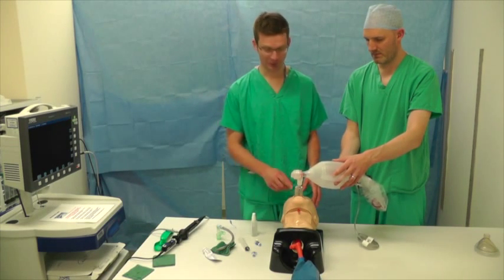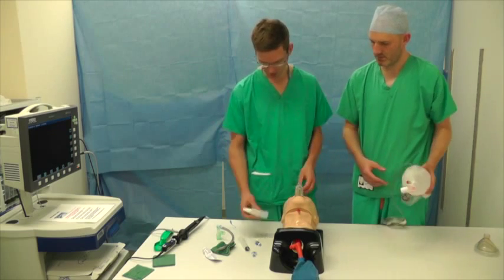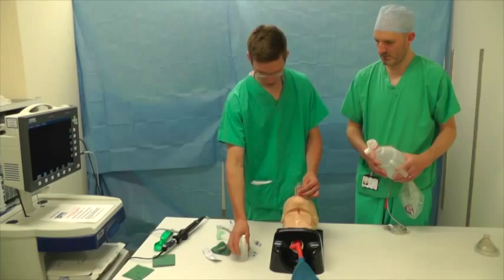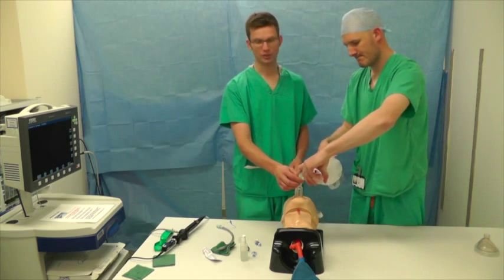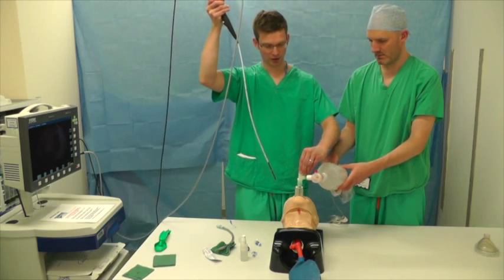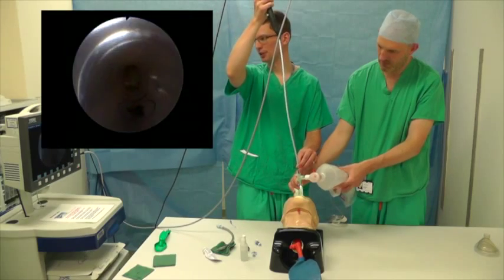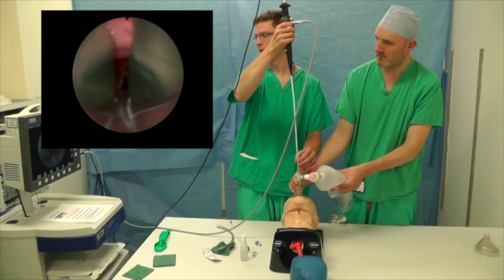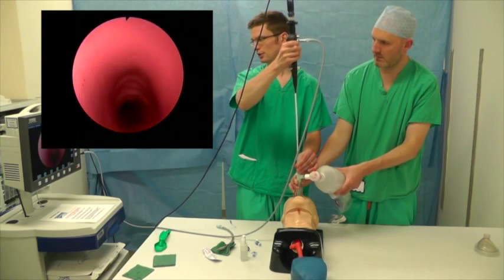Once you're happy you can ventilate, you need to lubricate the inside of the iGel — you only need to do this on the mannequin, not on a real patient. Disconnect briefly, apply a couple of sprays of mannequin lubricant, then attach the self-sealing diaphragm angle piece to maintain your anaesthetic. Get your prepared scope and Aintree, open the diaphragm, and ask your assistant to stabilize the end as it goes through. Now follow yourself on the camera — we're going down through the iGel, keeping the hole in the middle. You can see the distal end and ahead the vocal cords. Go through those into the trachea.